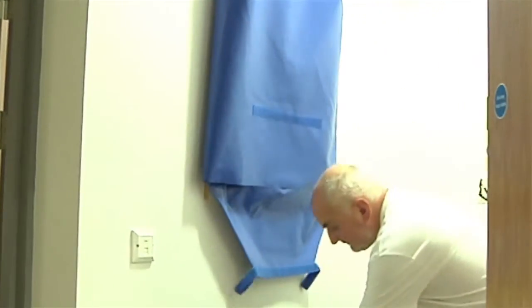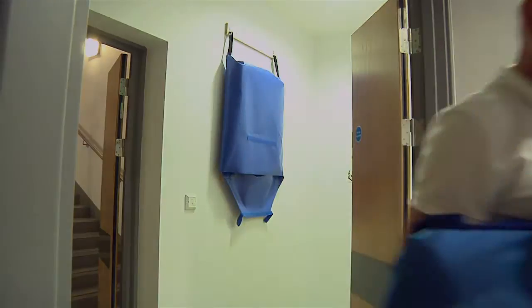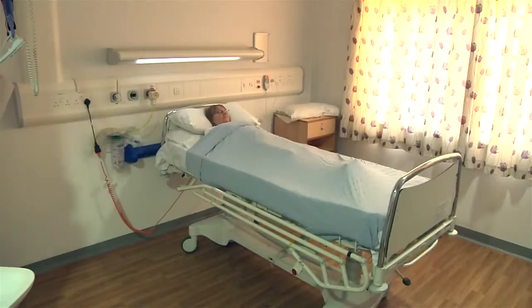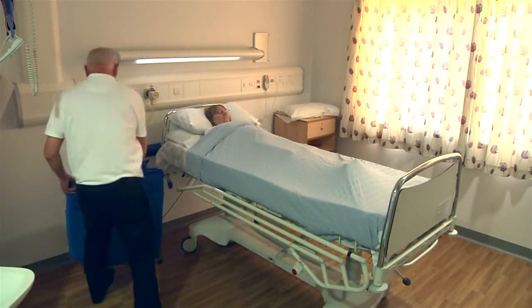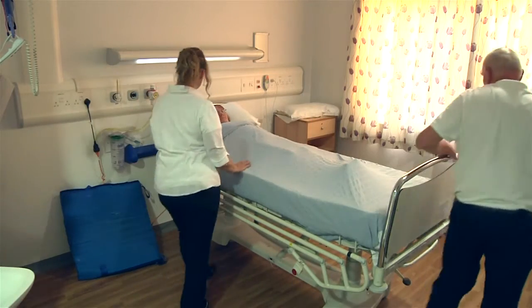When required in an emergency, release the velcro strap on the outside of the vinyl case and the ski sled will automatically slide out ready for use. The ski sled can then be carried to the area where evacuation is required.